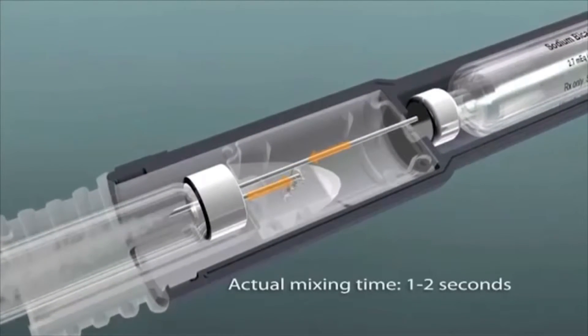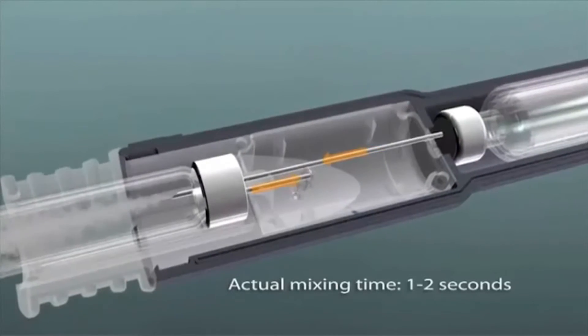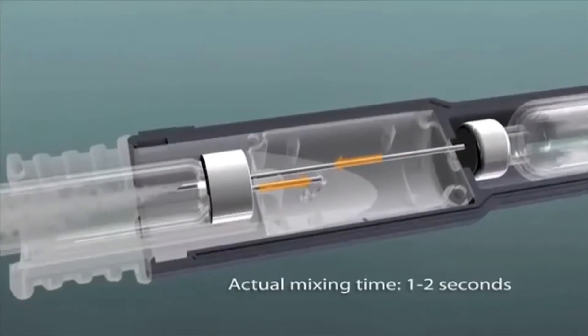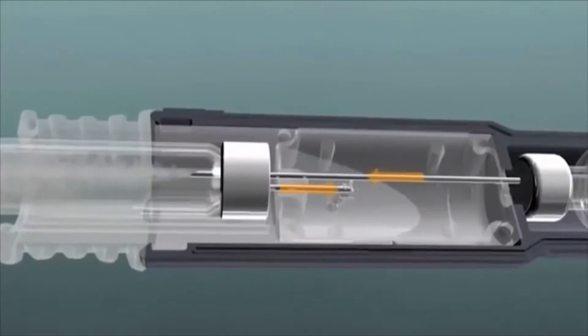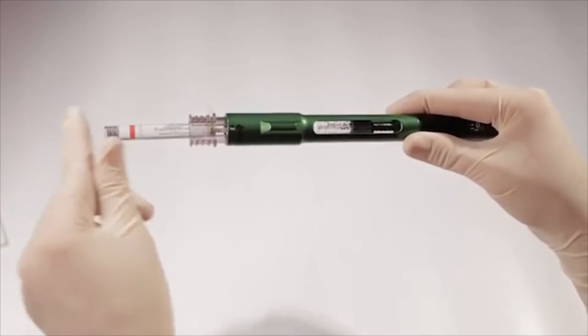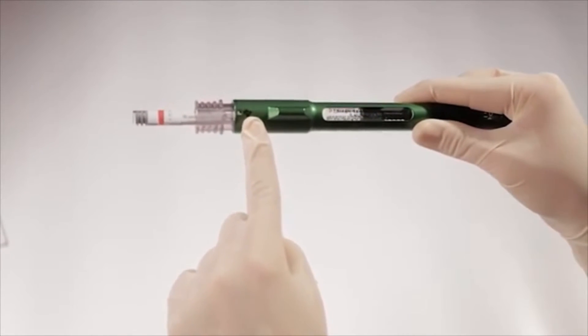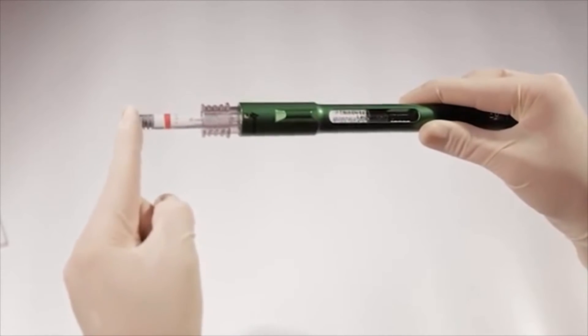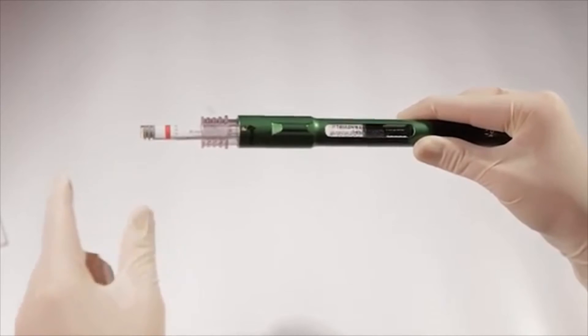However, if the 1.8-milliliter cartridge is not fully inserted and seated in the connector, the reservoir will not engage. And when you add fluid from the 3-milliliter cartridge during mixing, the excess will have nowhere to go. This causes the plunger to be pushed out of the 1.8-milliliter cartridge. To prevent this, when loading, always be sure to press the 1.8-milliliter cartridge all the way into the number one position, where you'll feel a slight click.